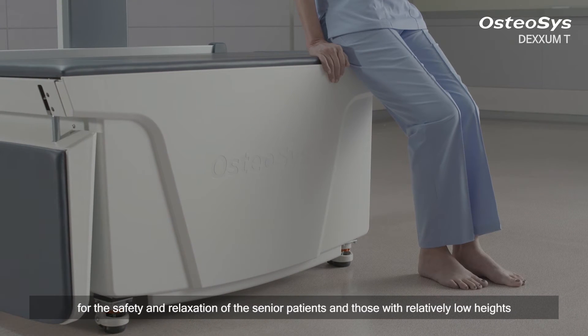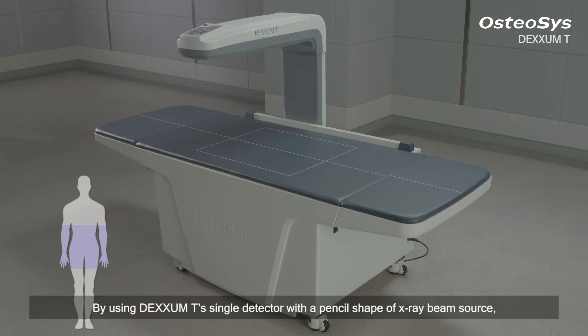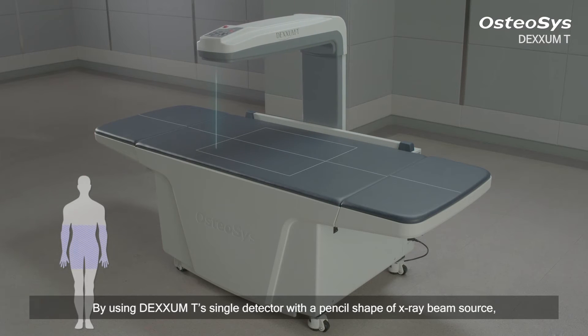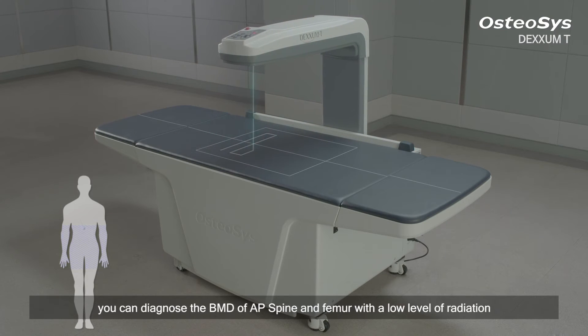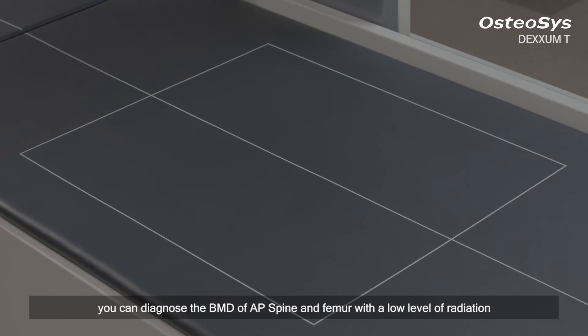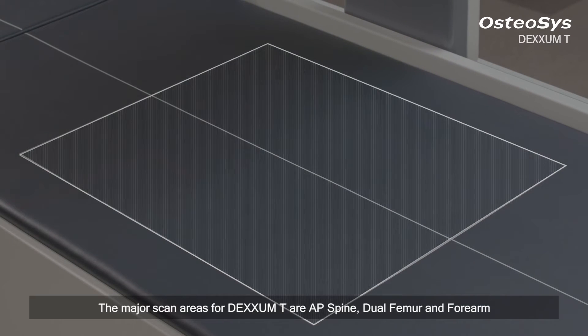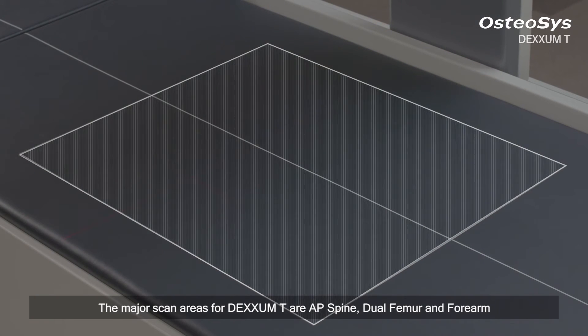By using DEXM-T's single detector with a pencil shape X-ray beam source, you can diagnose the BMD of AP spine and femur with a low level of radiation. The major scan areas for DEXM-T are AP spine, dual femur, and forearm.